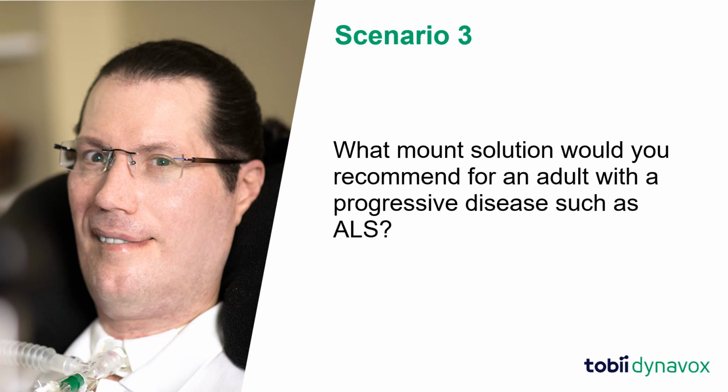Understanding the progression of the disease may be helpful in understanding the current and future needs of the mount. Today, they may benefit from a table mount, but if the disease is progressing rapidly, consider a wheelchair mount for someone that is ordering a wheelchair. Another question might be, do they have a wheelchair? If not, and they want to get a wheelchair mount, do they know what model chair they are getting?